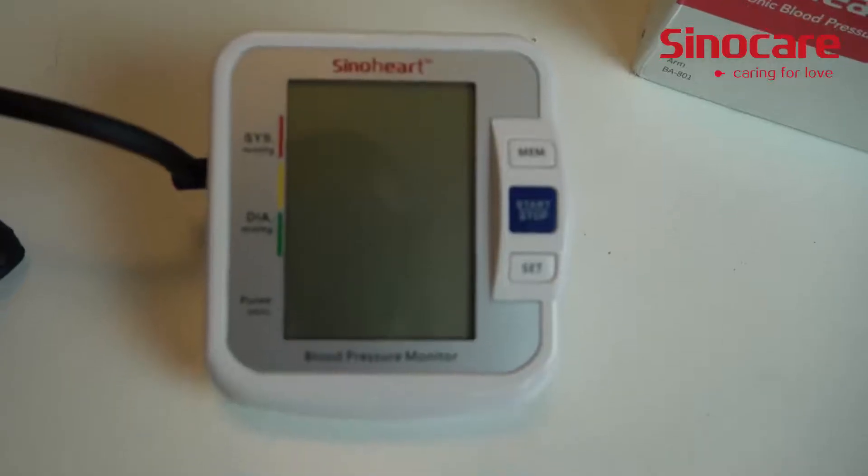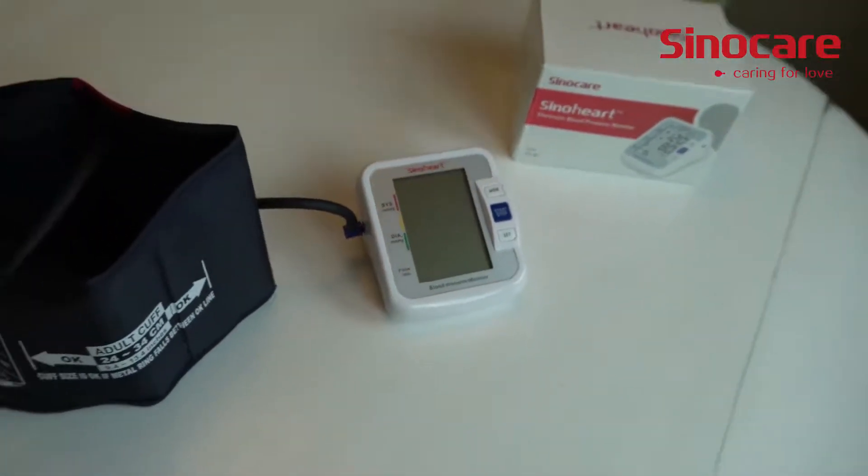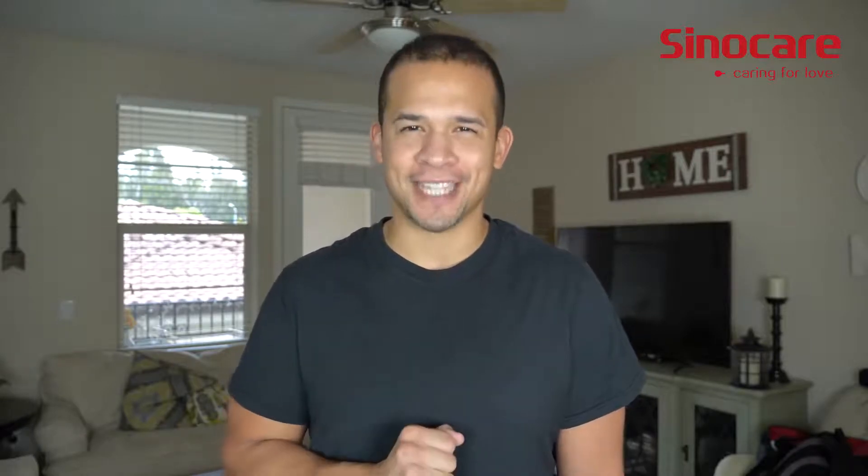It has a nice large screen with an LCD display, making it very easy for anyone to read. And as far as learning how to use it, there's no learning curve — it has a voice direction that tells you what to do every step of the way.